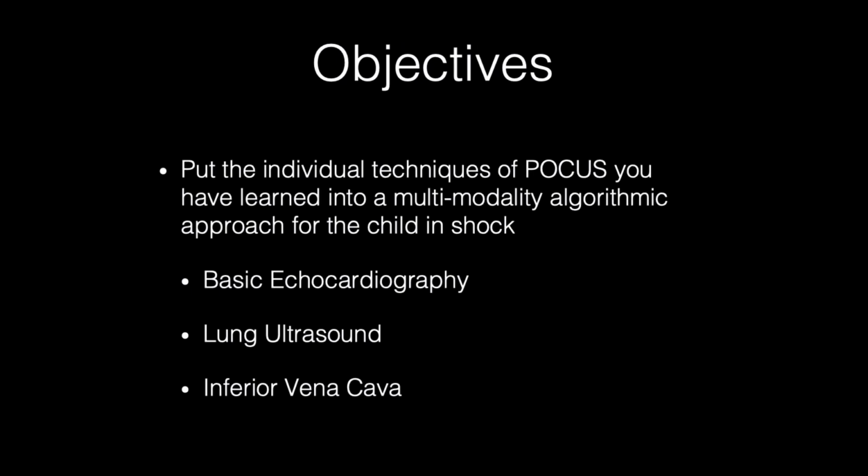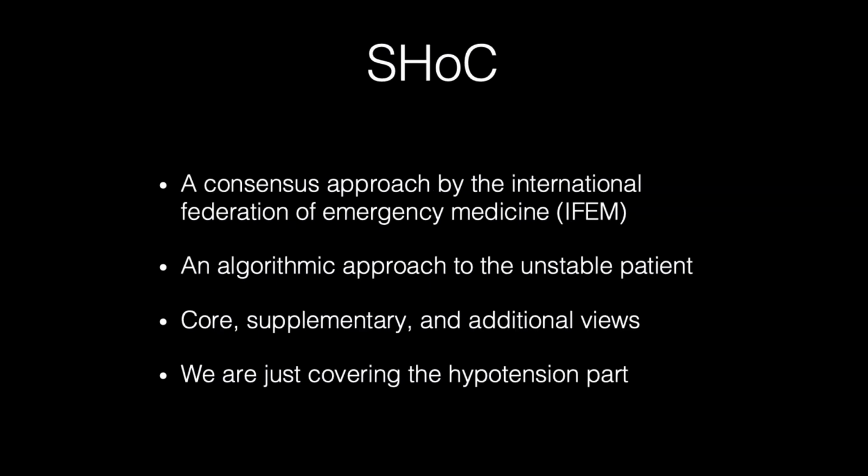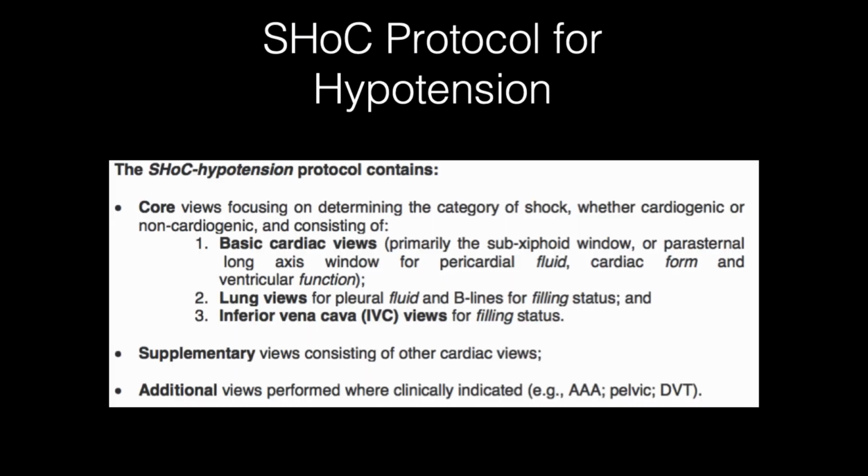No disclosures. The objectives: we're going to learn about basic echocardiography, lung, and IVC ultrasound to help manage the patient who's in shock. I'm first going to review our algorithm and our approach, how we categorize shock with ultrasound, and talk a little bit about the International Federation of Emergency Medicine's consensus statement on shock.